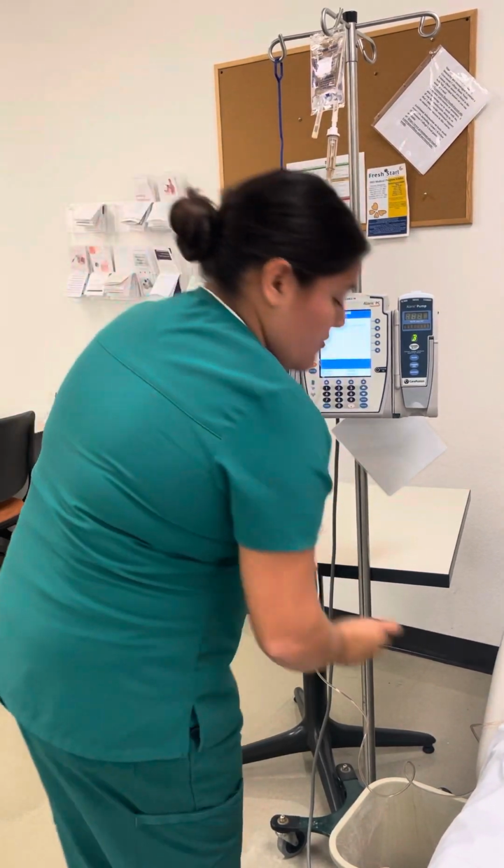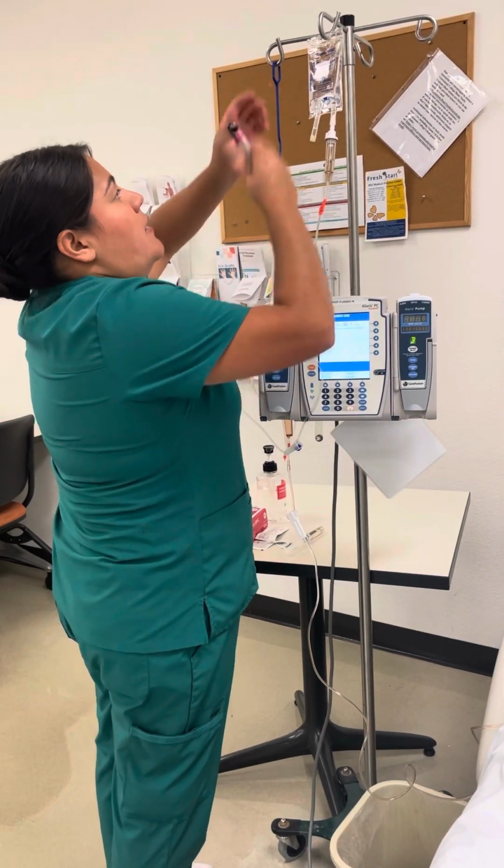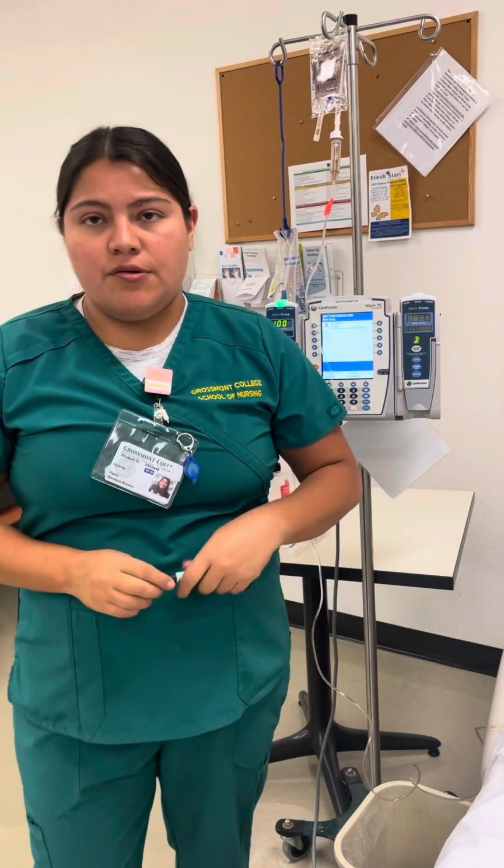I see that is the drip, and I will label with my initials and the time that I started. And then I will proceed to document.